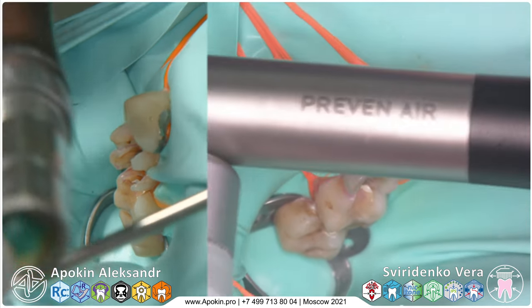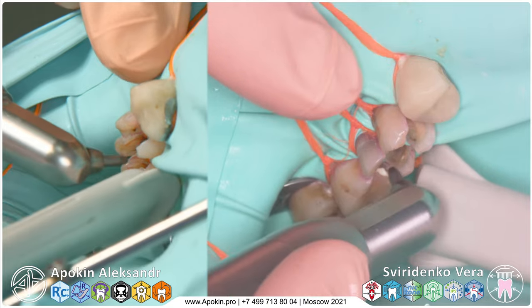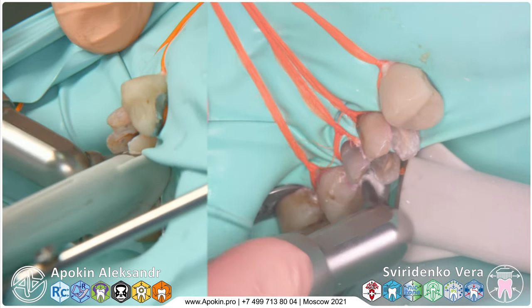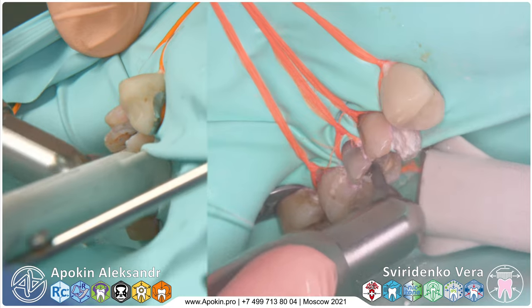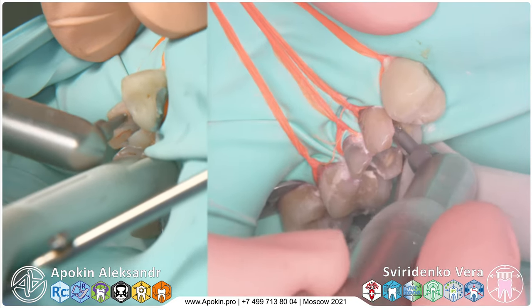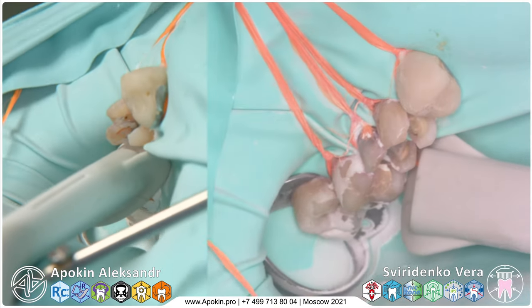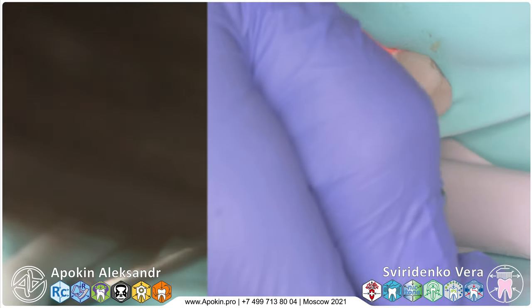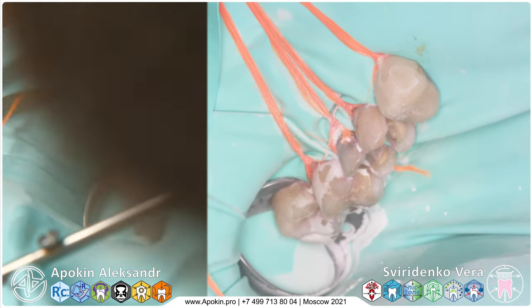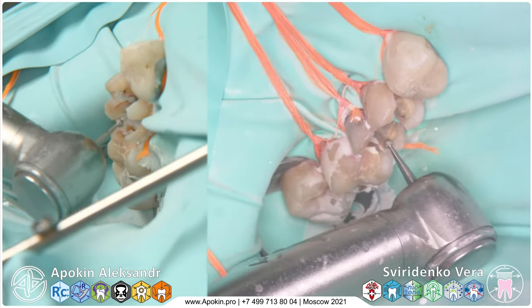We're starting to work with the sandblaster with aluminum oxide, 24 microns, without water. I like it more than with water because this is more aggressive in removing organic material from hard tissues. Sometimes we find that we need to prep the hard tissues again in some areas.